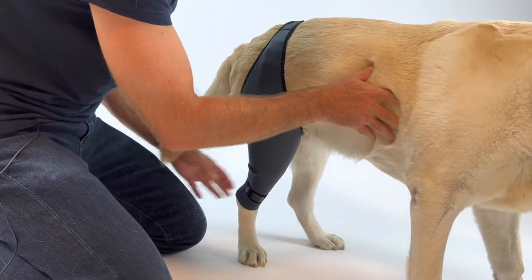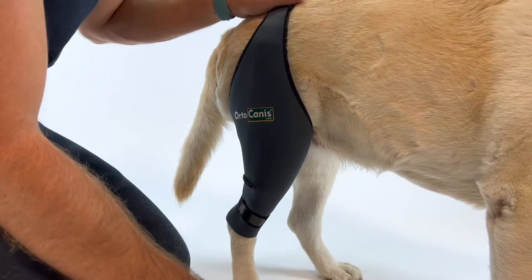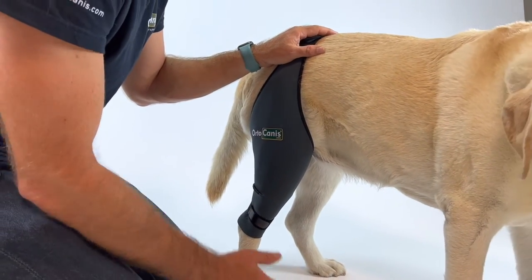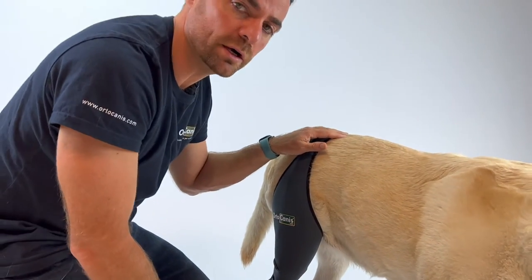It is normal that the knee goes out of the knee brace when the dog slides down. The important thing is that when he stands up again, the knee brace goes back to its place within one to three steps.